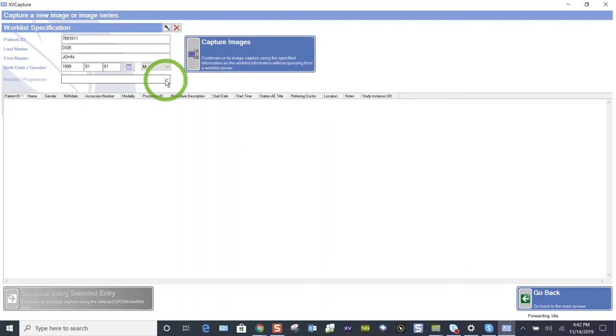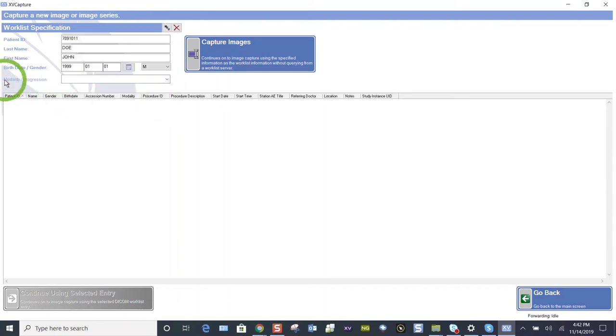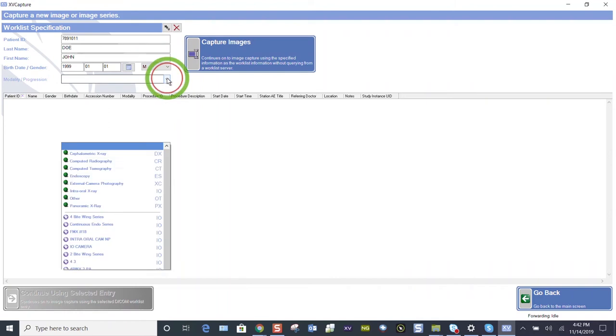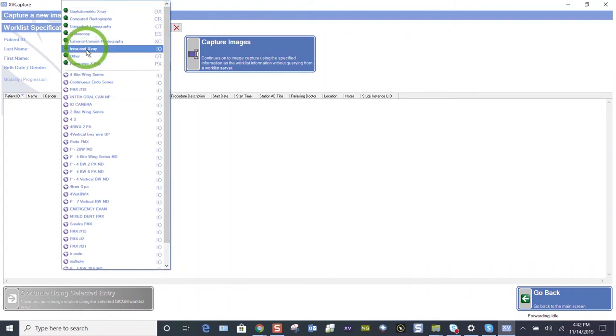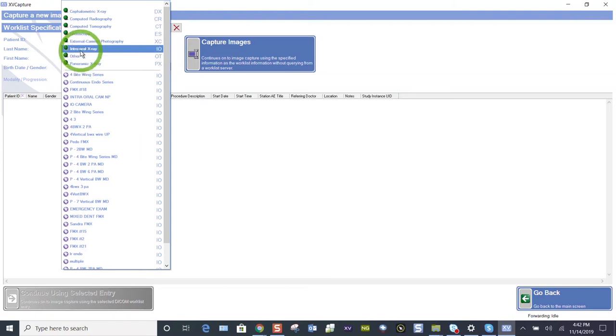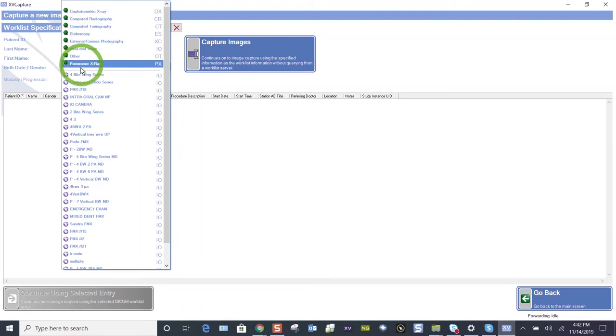Whether you're using digital sensors or phosphorus plates, let's find the drop-down menu. This is the modality and progressions. Progressions are our layouts. Let's find our FMX 18. You see the top part of this list is for your panoramic, your intraoral, your camera, which would be your intraoral camera.